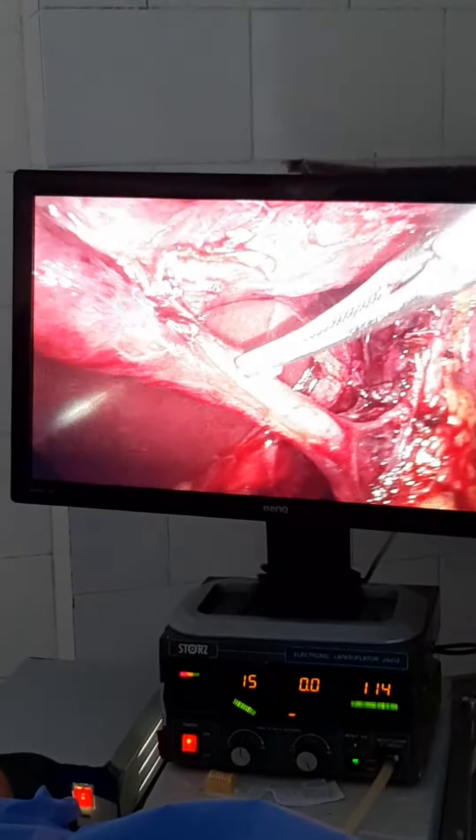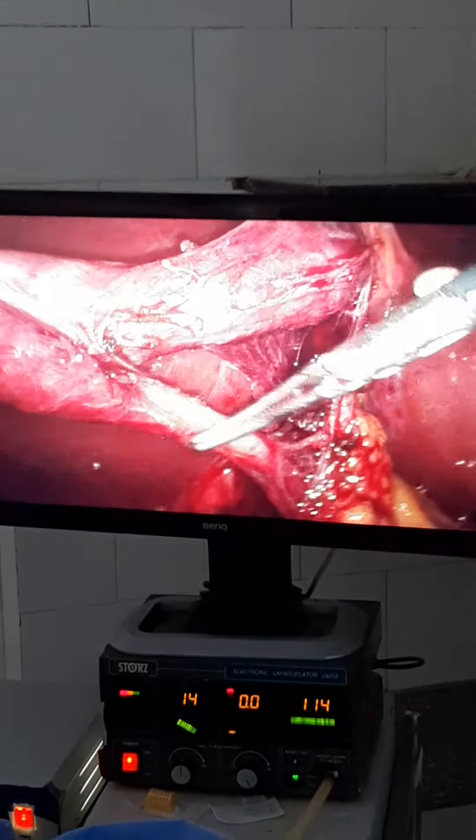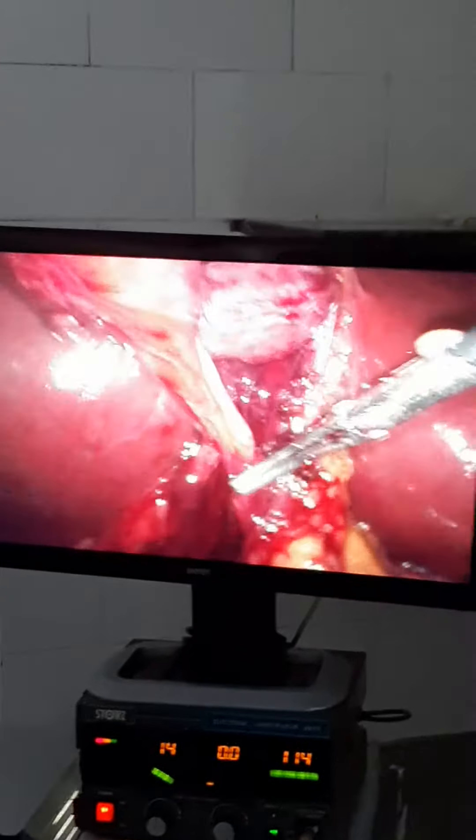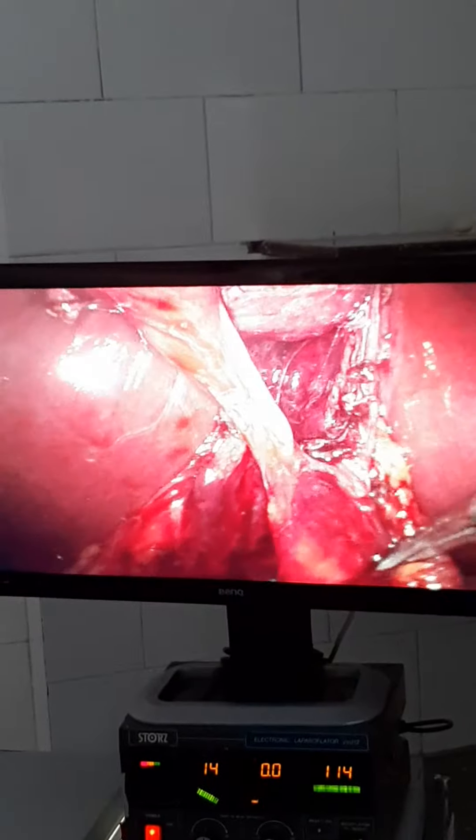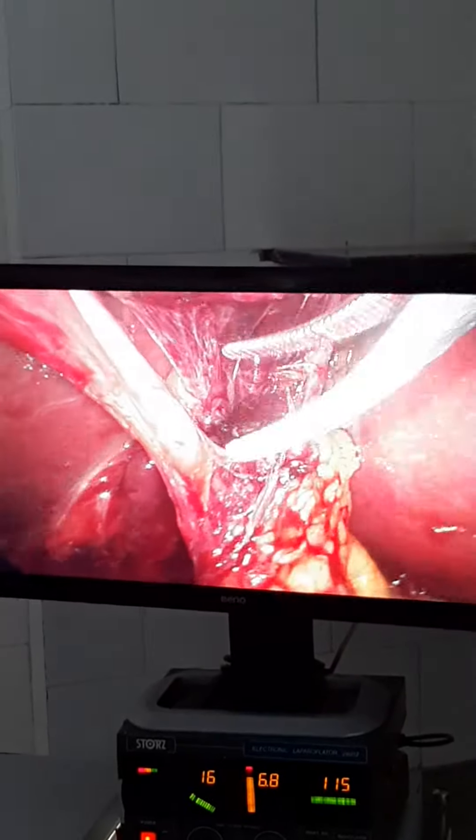So if we put a clip here and divide, we can see another duct coming here. To avoid this, we have to dissect the cystic duct for the whole of its length up to the common bile duct. This is the CBD here. You can see the CBD, the cystic duct–CBD junction, and this is the cystic duct.